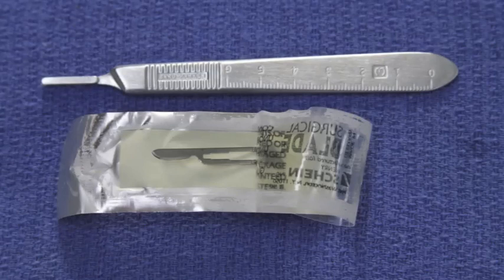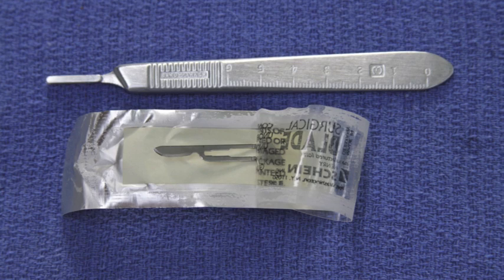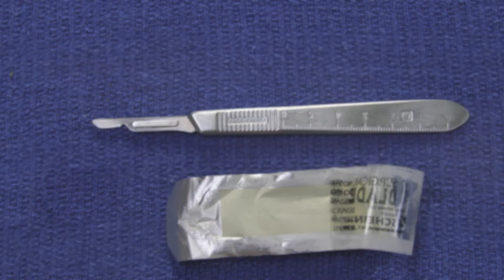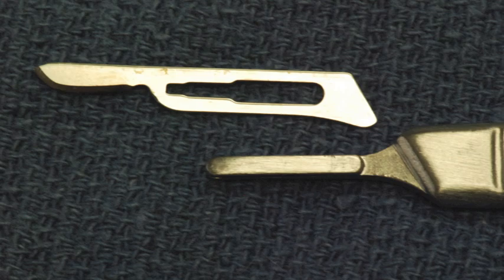Because of you working as a volunteer, we are not going to expect you to do this, but rather the full-time assistants will be setting up these scalpels, and you may be working with the surgeon to pass them over. Do not attempt to assemble or disassemble one of these instruments unless you have been personally trained by one of the full-time staff.